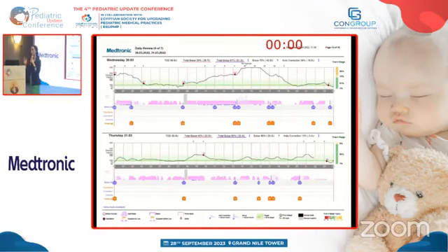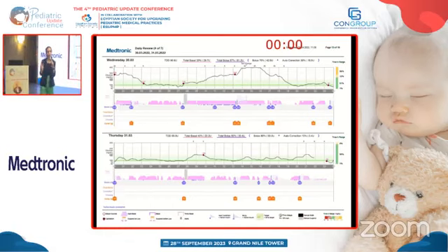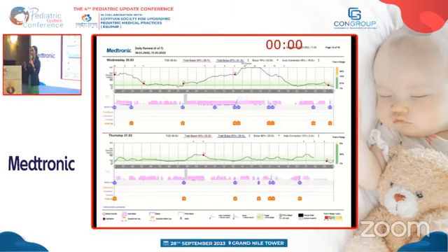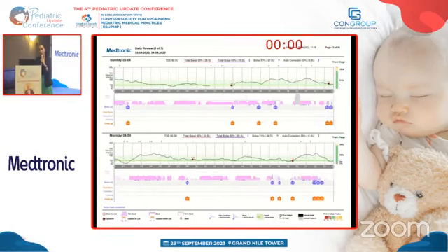عمل الريسبونس طبعا احنا بنستنى بعد لما الدنيا بتبوس خالص عشان نقرر ناخد اكشن بان احنا هنغير الكانيولا بتاعتنا او لو ده التايم بتاع كمان تغيير السات كلها بالانسولين. فهنا وانس ان هو غير، هنلاقي مكتوب فوق سات تشينج. وانس ان هو غيرها بدأ بعد كده ان الدنيا تنزل عنده تاني عادي للنورمال رينج، وده كان اقل يوم عنده اللي هو 31%، وده هيبقى اثر عنده في التوتال بتاع التايم رينج.